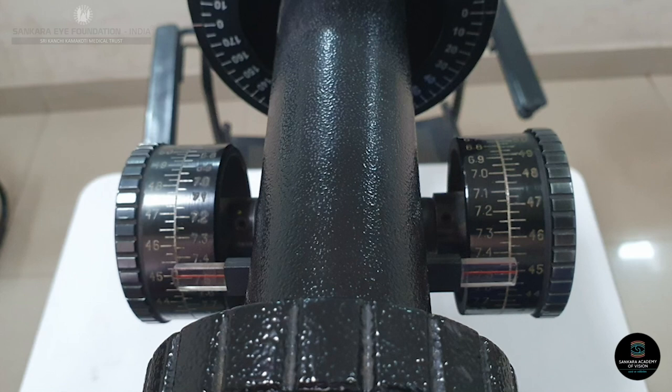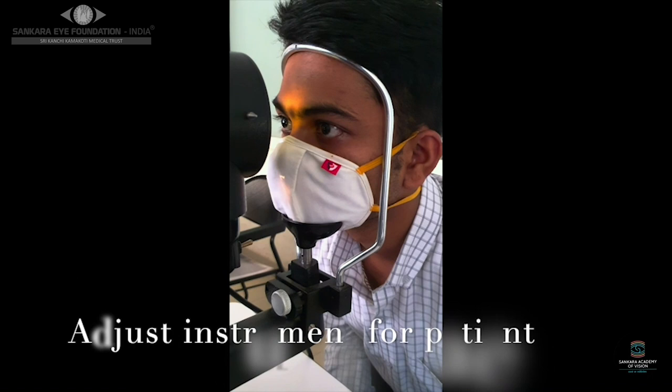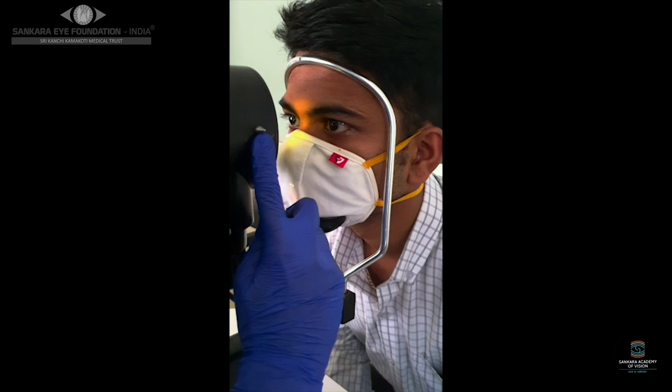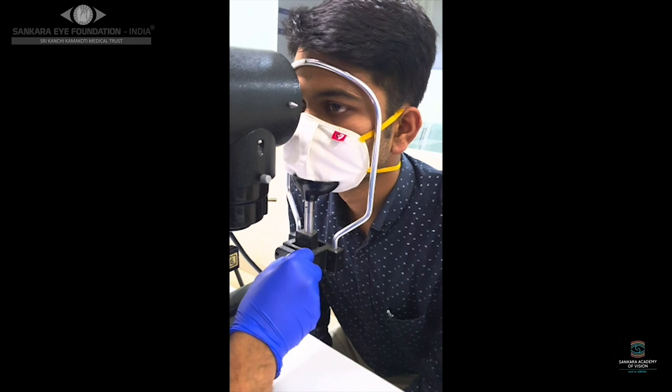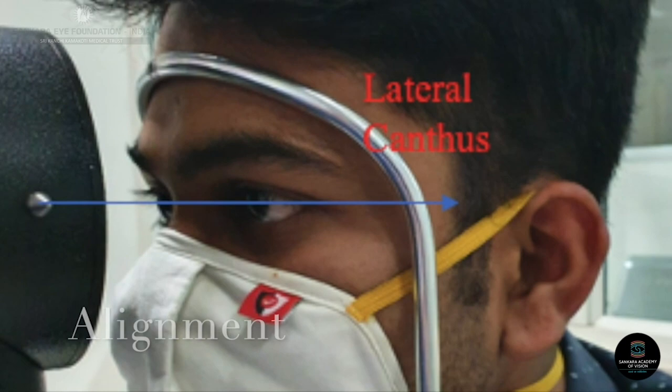Focus the eyepiece of the keratometer for the examiner's eye. Set the adjustable eyepiece as far counterclockwise as possible, then turn the eyepiece clockwise until the reticle or plus sign is first seen in sharp focus. Adjust the height of the patient's chair and instrument to a comfortable position for both patient and examiner. Instruct the patient to place their chin on the chin rest and forehead against the forehead rest, then raise or lower the chin rest until the patient's outer canthus is aligned with the mark on the upright support of the instrument.